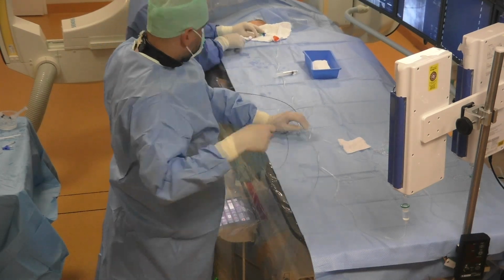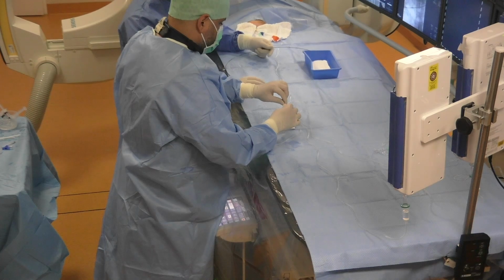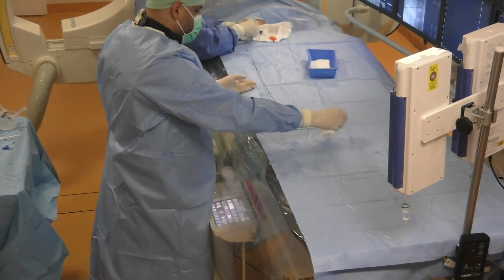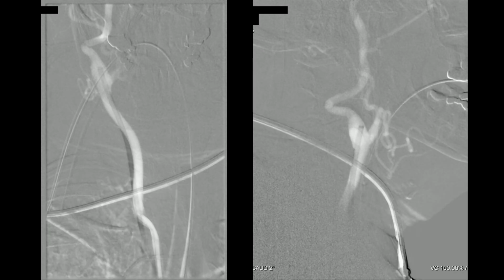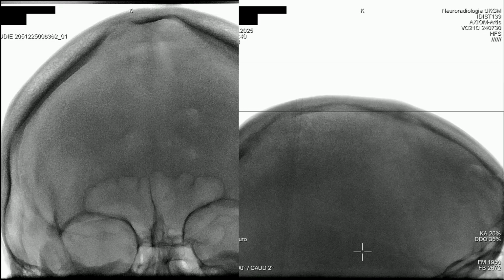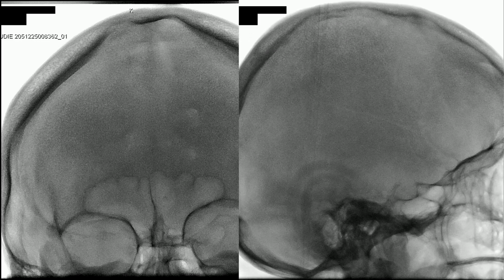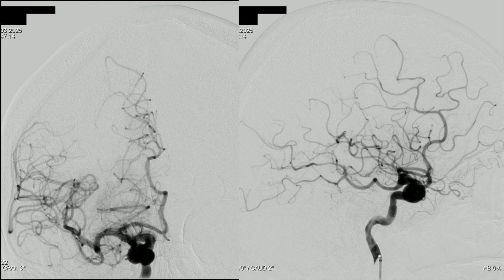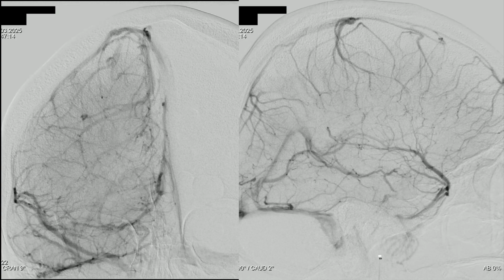We remove the select catheter with the Terumo guiding wire and take our intermediate catheter, Sophia 5F, flush it, and push it inside the NeuroMax long sheath. The Sophia catheter is so soft that we can navigate without the need of the guiding wire. Now we need an overview to see the anatomy and the aneurysm. And here we see the aneurysm with the contrast agent swirling in the aneurysm sac.